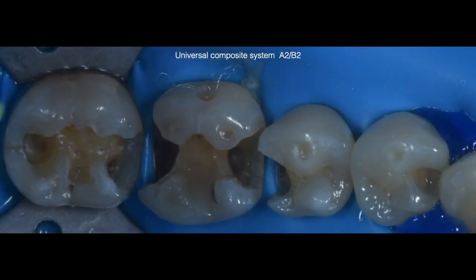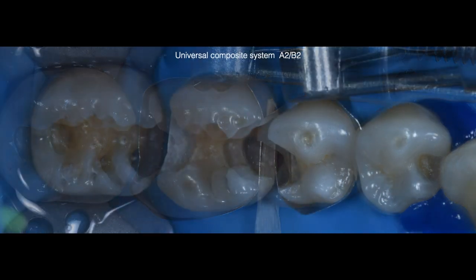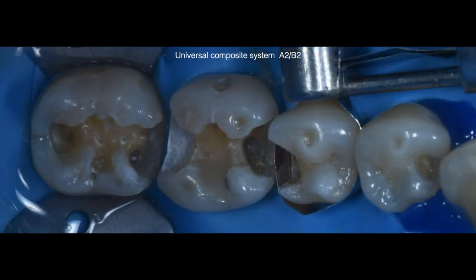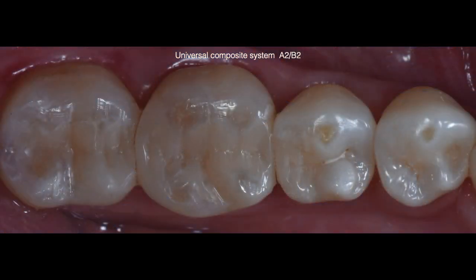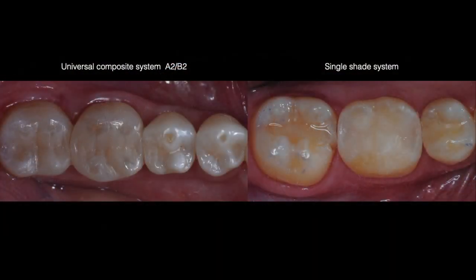All preparations have been completed. We started out with deep margin elevation on tooth number 19 followed by deep margin elevation for tooth number 20. In both cases we used resin modified glass ionomer. This was right after all restorations were completed. As you can see, for the smaller preparations the restorations were almost imperceptible and a very good match for the larger restorations. Here is a side-by-side comparison for both cases immediately after completion.